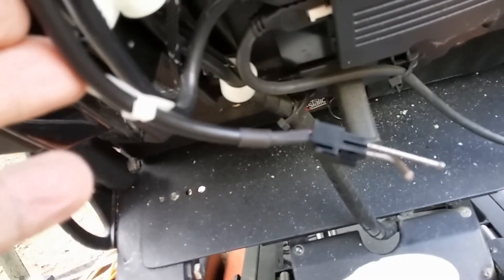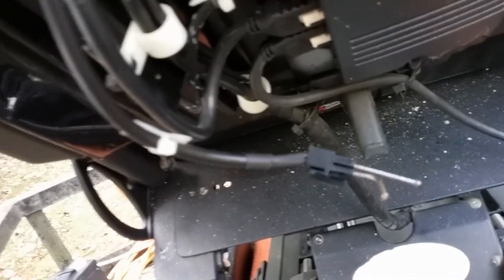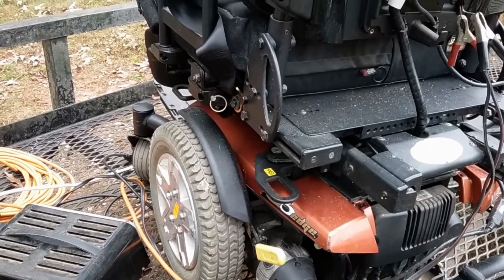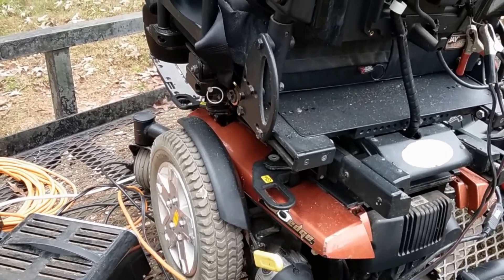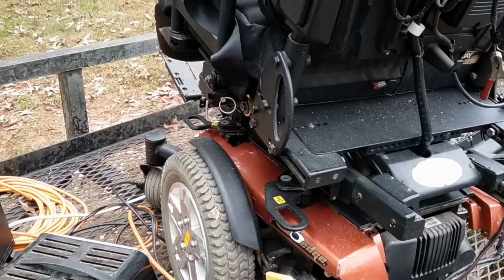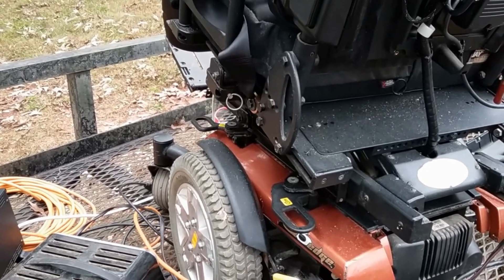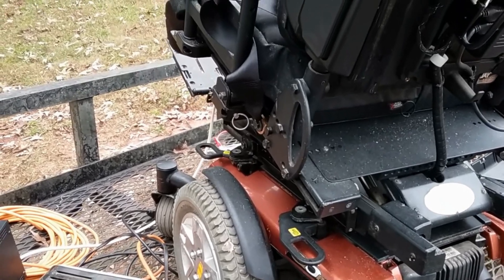This is the tilt wire. What I did was put two nails into it and hooked up the battery charger to those two nails, which allowed me to tilt the chair upwards. The tilt wire is connected to the control panel on the back of the chair and I just unplugged it to be able to use it.